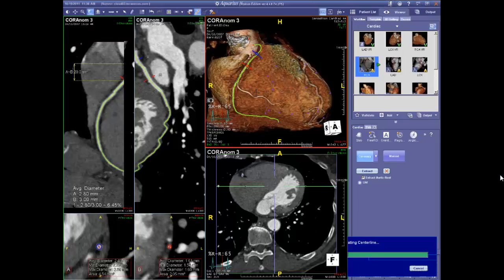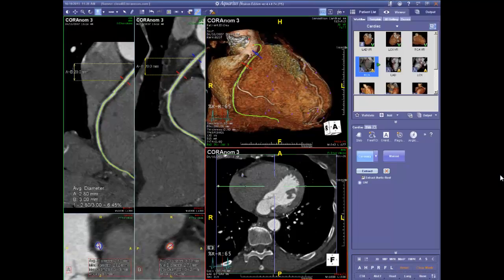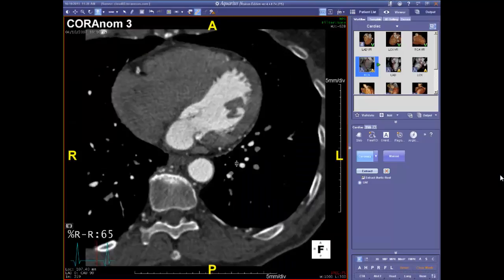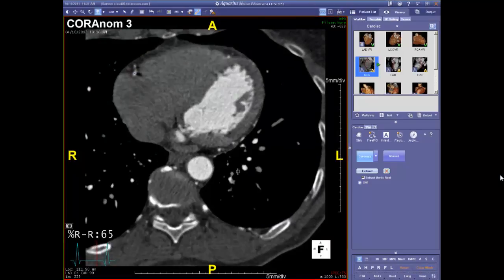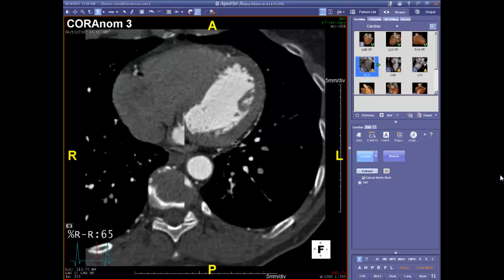It should go ahead and successfully connect it. Those of you who've read this will notice that this is a funny way the right coronary artery runs - sort of up the AV groove and then turns sideways, still taking an anterior takeoff which is typical. I think this screen down here will enable me to slice up and down and let's look at what the standard axial images are doing here.